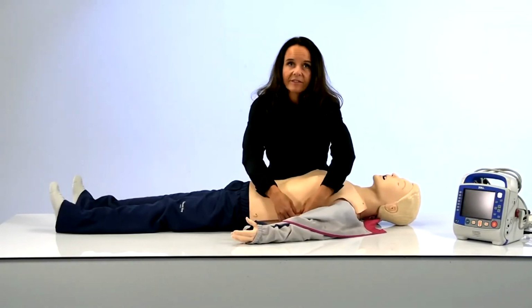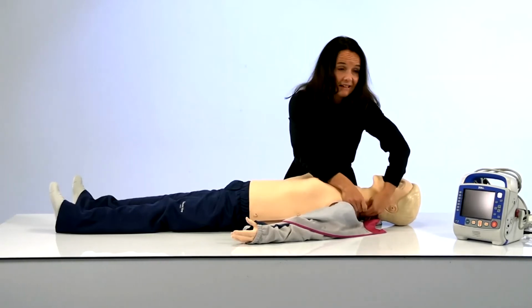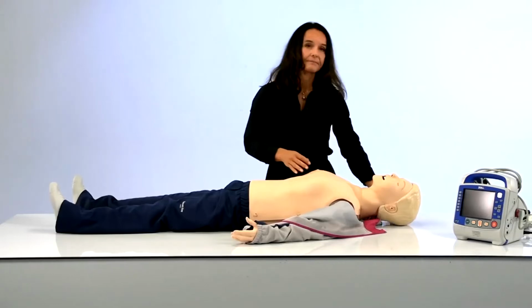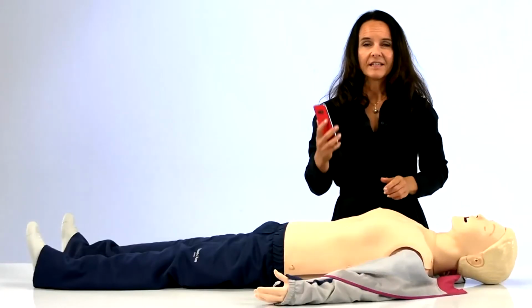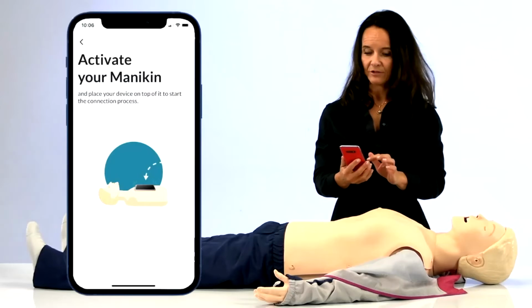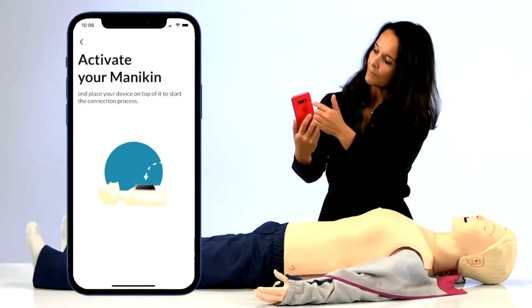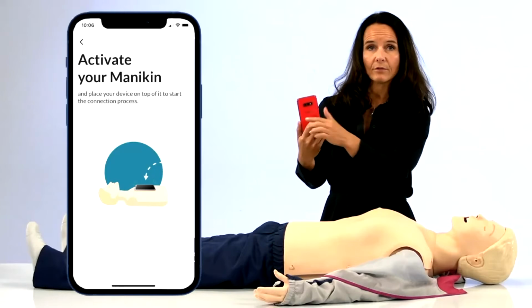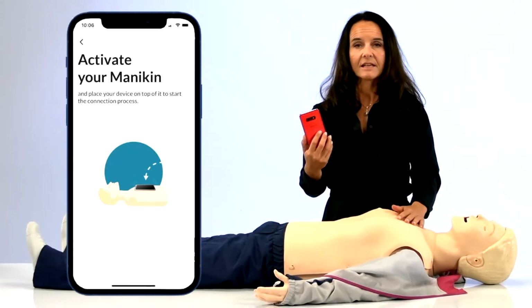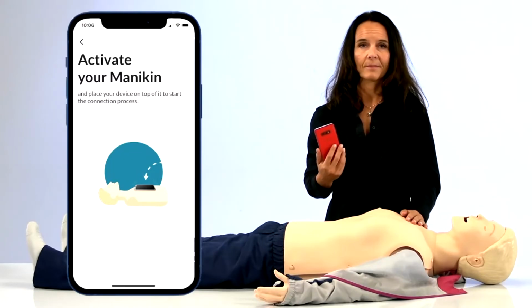Unfortunately, I can't do a live demo of Team Reporter since it's a team training solution and it's just me here, but I can tell you about it. Team Reporter is our newest app designed for high-performance team training, and it makes training fun. It works by combining the video from your phone with QCPR feedback from the mannequin. This creates a powerful training tool for instructors.